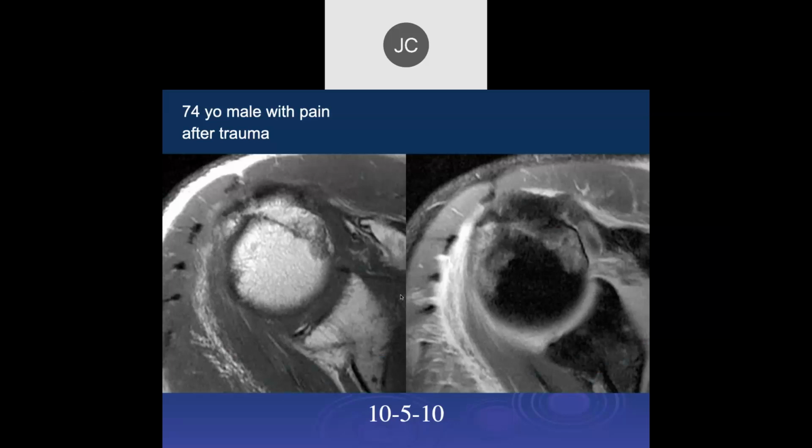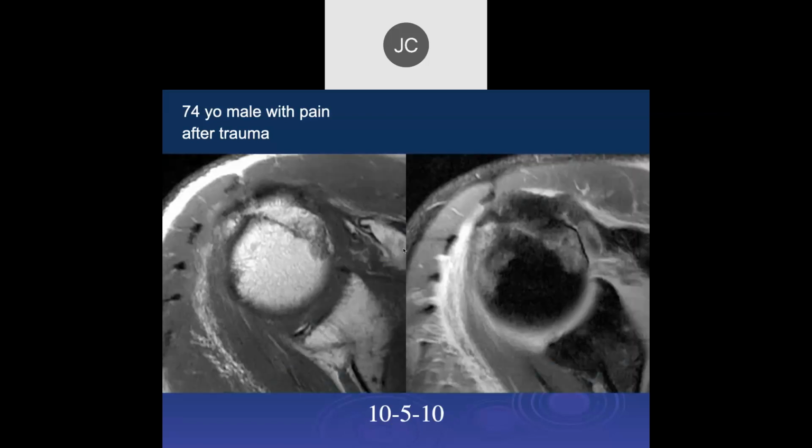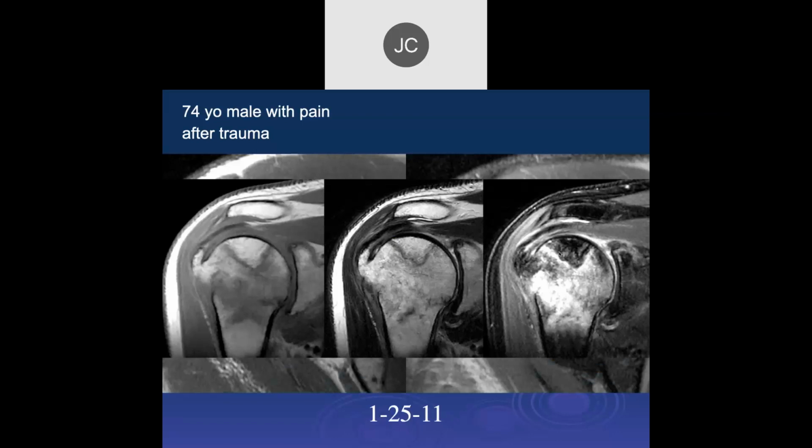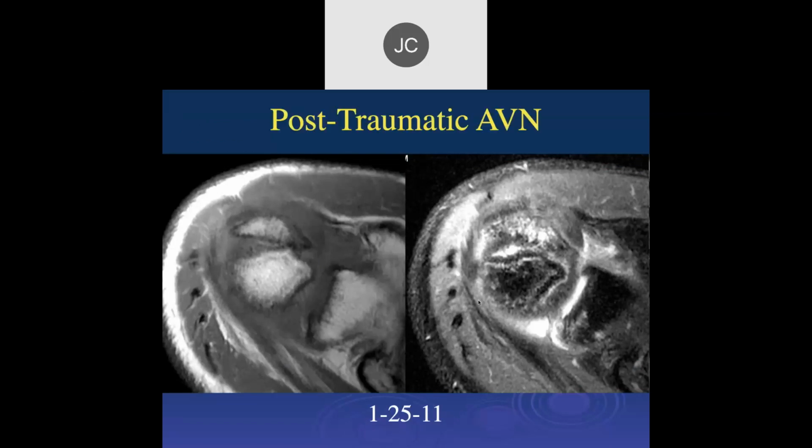Now the patient comes back 3 or 4 months later, and this is what it looks like. I would say there are areas of sclerosis, but it's non-healed. It's like a non-union. You see a lot of stuff here. If we go back here, that looks normal there. But now you've got almost a double line sign there. It's very irregular, with a margin a little bit like a snake. And this is a post-traumatic AVN, because that segment of bone lost its vascular supply.